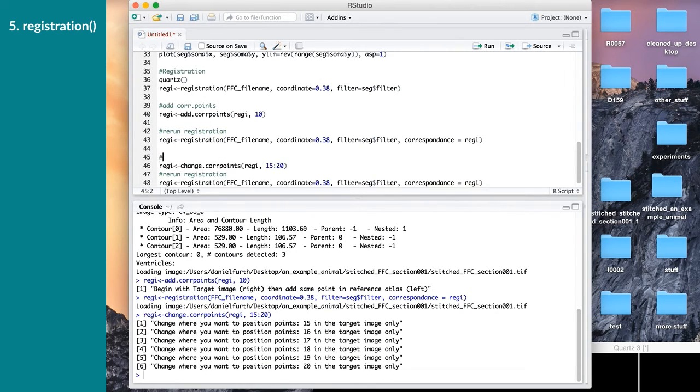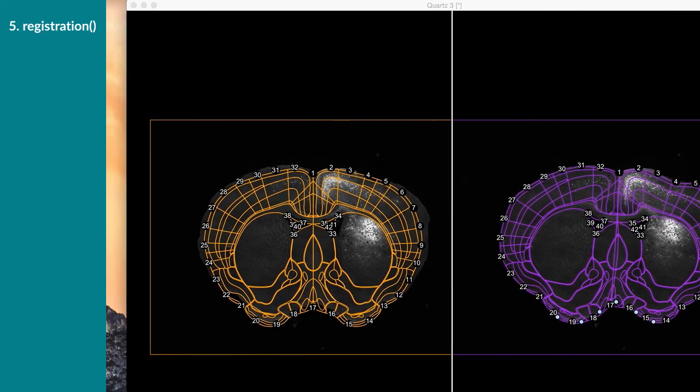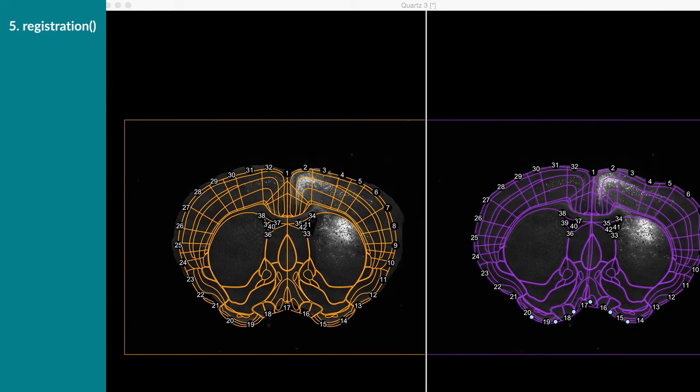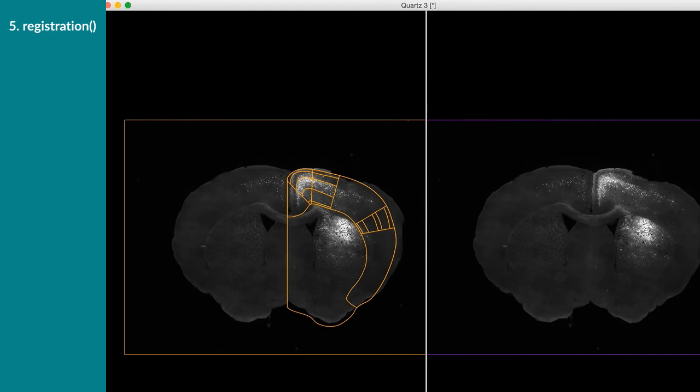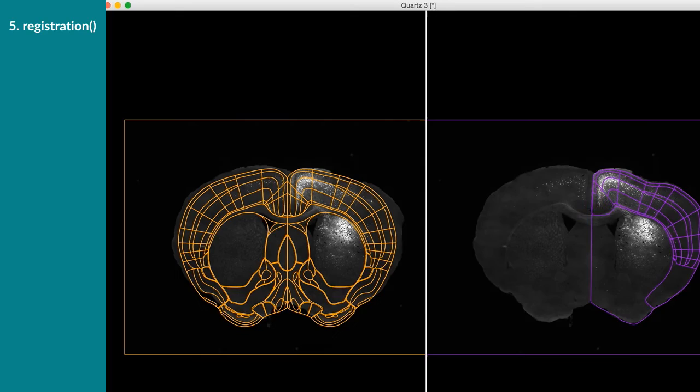So yeah, just comment here that this is a change of core points. Okay, so we just rerun it and we will look as it produces the output here for us. Okay, there it starts plotting. Okay, you can already see that the midline is properly placed now.